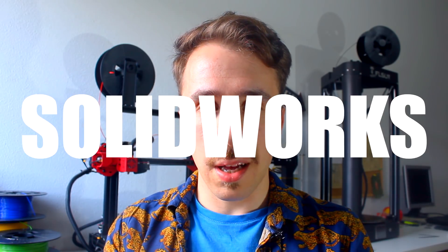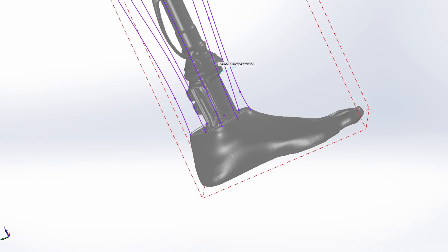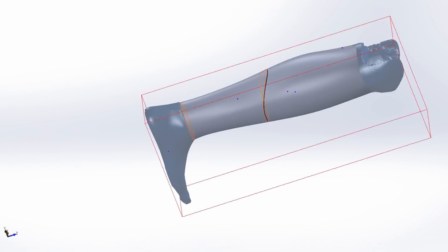To translate the designs into 3D models, I used SOLIDWORKS, an insanely expensive CAD software that you don't have to use. There are great 3D modeling softwares you can download for free, like SketchUp or Fusion 360. For starters, I used the exported files from MeshMixer as reference to create a leg-shaped surface that I could thicken and use as the main shell.